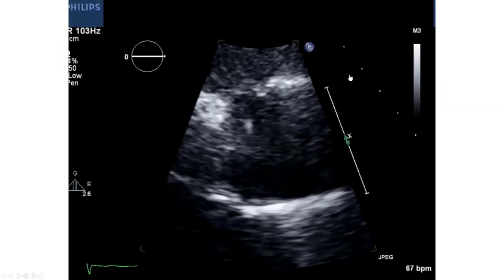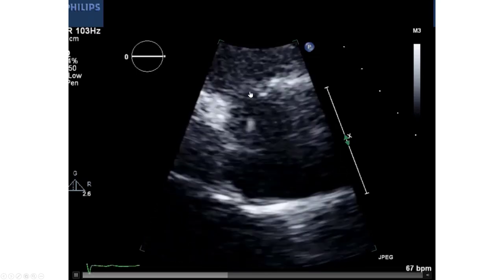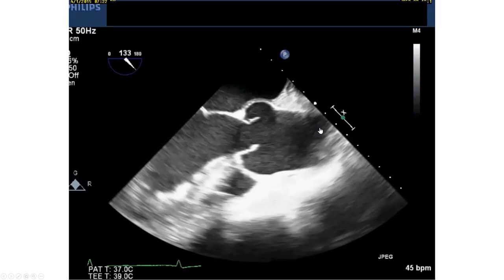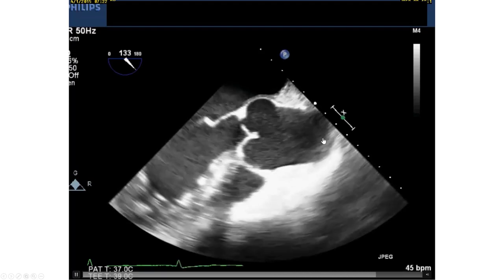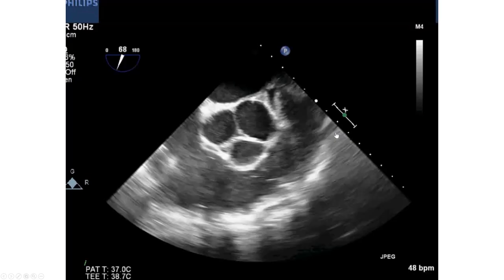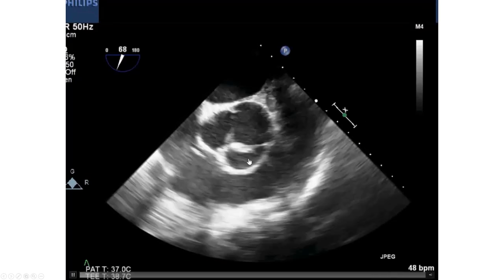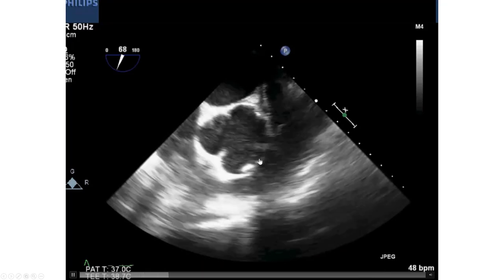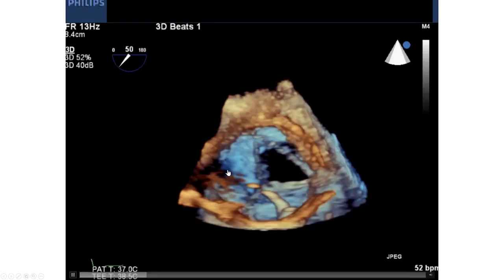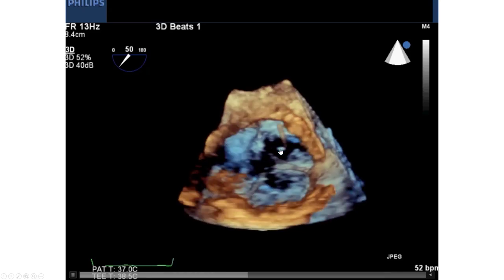This was confirmed with echocardiography. On transthoracic echo, we can see the wire coming from the right cusp and protruding all the way into the aorta. The patient went emergently to the operating room. On the intraoperative TEE, we can see the wire all the way out in the aorta, and in a three-dimensional view, the wire essentially swinging inside the ascending aorta, originating from the right coronary ostium.